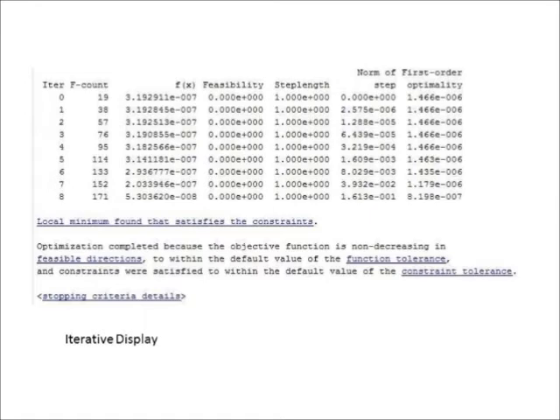That is, its initial location before the next point in time. Here, we randomized our test cases and found that the further away the initial guess is from the actual point, the less accurate the optimization will be. This is because an optimization algorithm is sensitive to initial guesses.